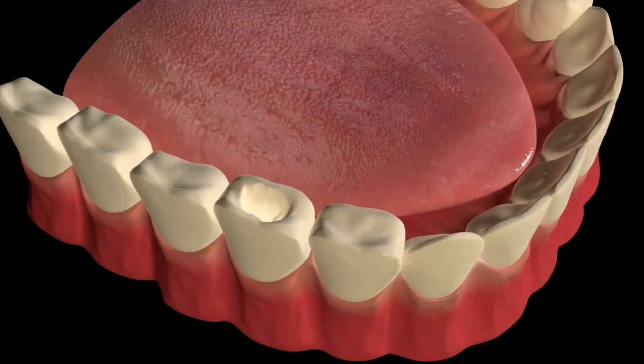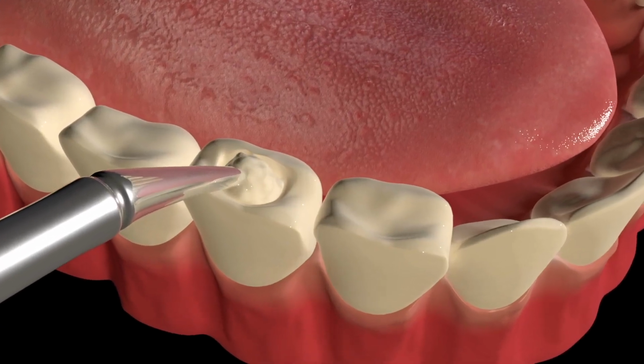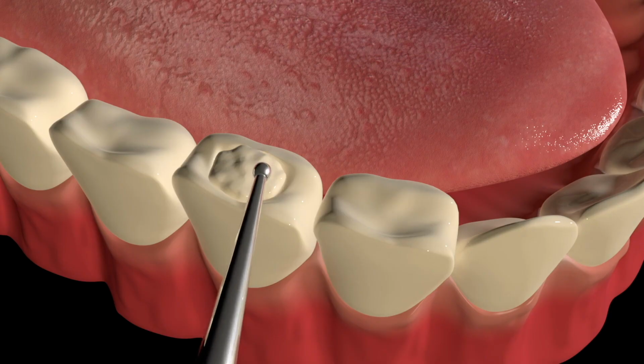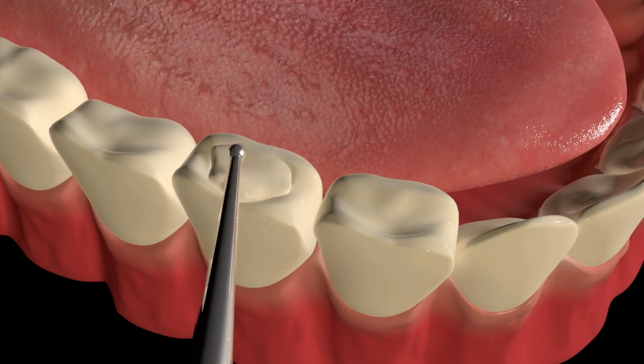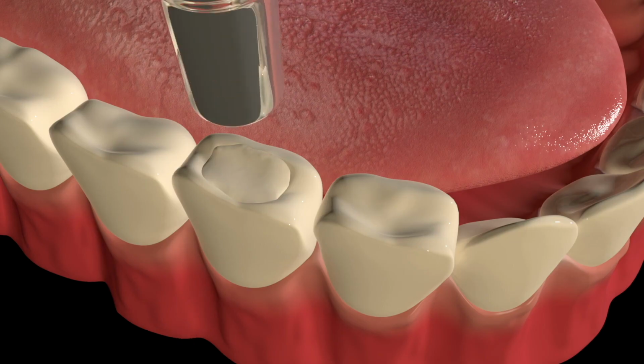Once the tooth is numb, the dentist uses a high-speed dental drill, or in some cases, a dental laser, to remove the decayed portion of the tooth. The goal is to eliminate all infected tissue while preserving as much healthy tooth structure as possible. The cavity is then shaped and cleaned to prepare it for the filling material.